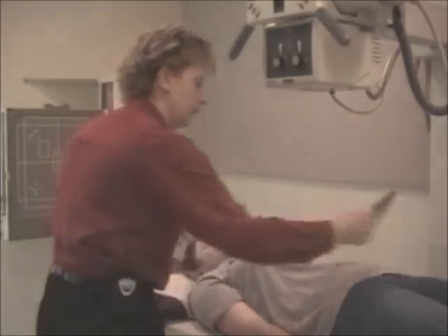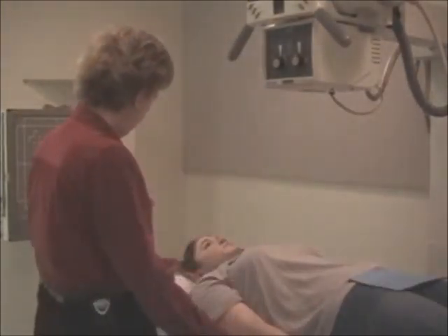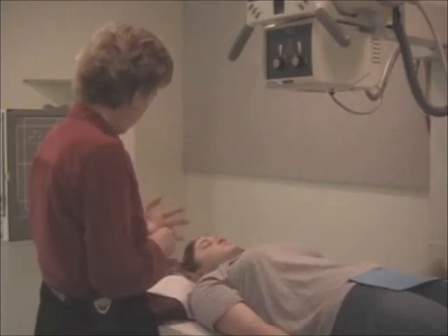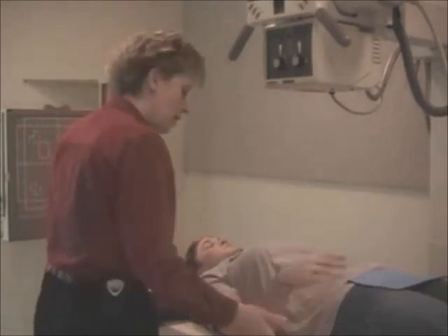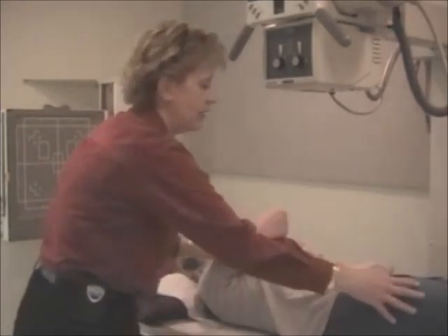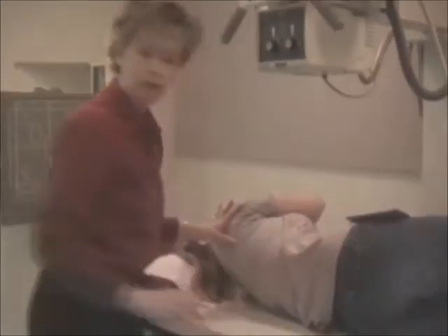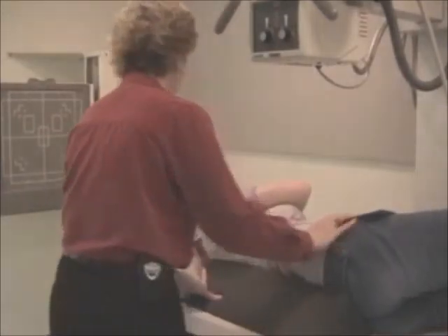Okay. Kristen, the only one I think we have left is an LPO. We did an AP and a PA. We did an RAO. We did the right and left lateral, so an LPO. Okay? We're going to bring this arm over your chest. Just bend the knee slightly, and we're going to roll you like a log. 30, 45 degree obliquity again. If they have troubles holding in place, don't hesitate to use a positioning sponge. Is that more comfortable?